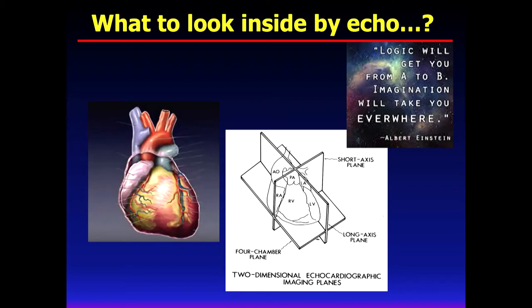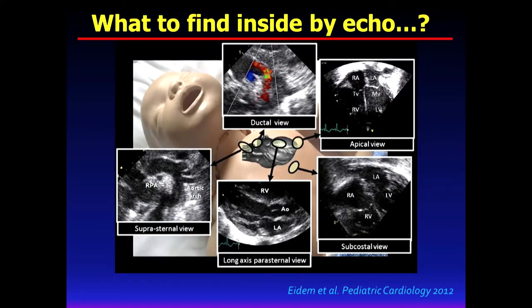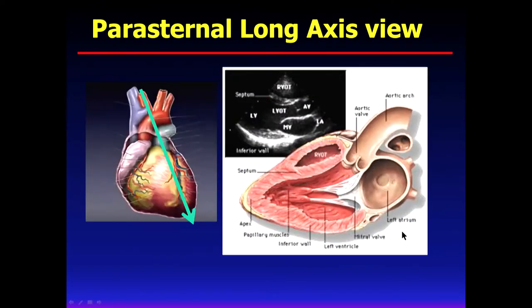And this is our heart, and we have a line like this in the illustration. We call that the long axis. Our heart is located here, and there is the long axis, and then the short axis, and then the coronal section opened like that. So we look at all these to make a 3D reconstruction in our brain. So this is the baby inside, and we can find the long axis here, and where is the short axis, and apical, and then ductal, and then suprasternal arch, and then the subcostal view. So we all look at this and make a 3D reconstruction in our brain. So let's go step by step.